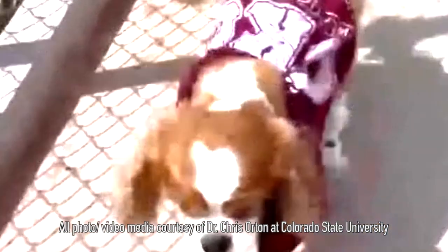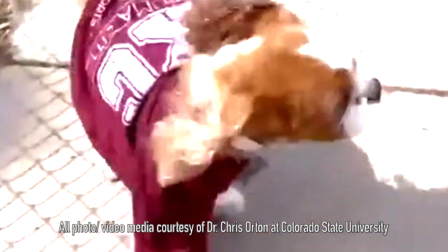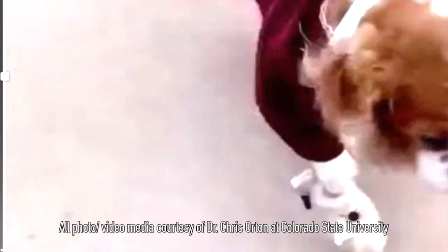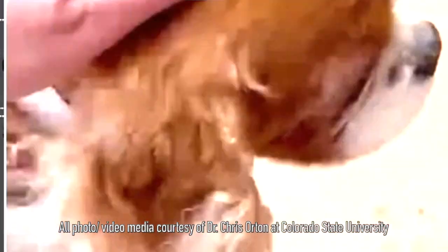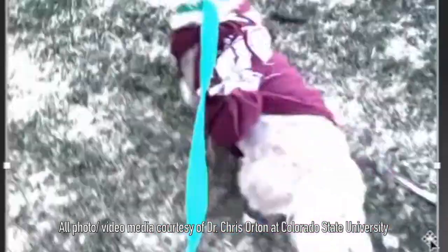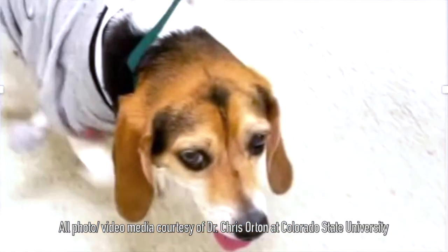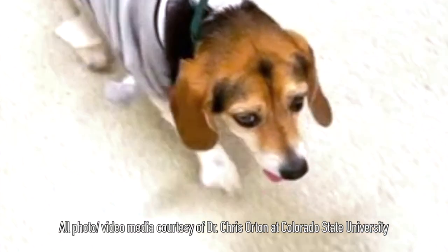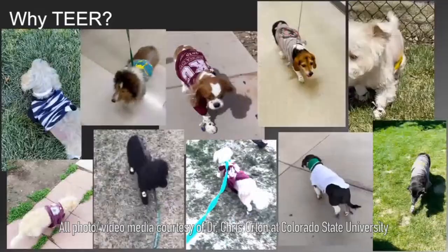I've truly been amazed. Dogs have walked outside the same day as the procedure. Virtually all dogs walk outside the morning after the procedure, and they can generally be discharged from the hospital on the first or second postoperative day. We usually clear them to travel home by the third or fourth day. We are very enthusiastic about what this might mean, and getting the information out is important. I worry a little that we might be overwhelmed with cases, but we're doing the best we can to get other centers going.